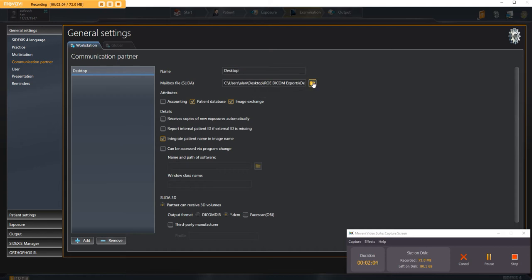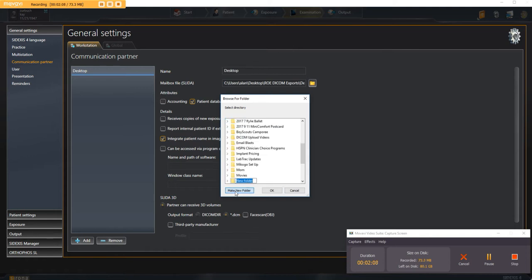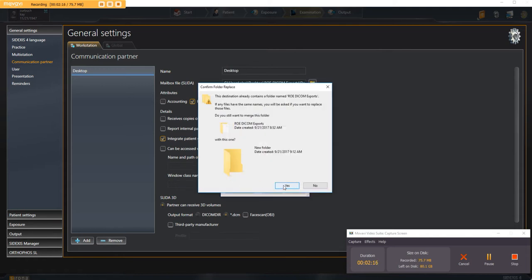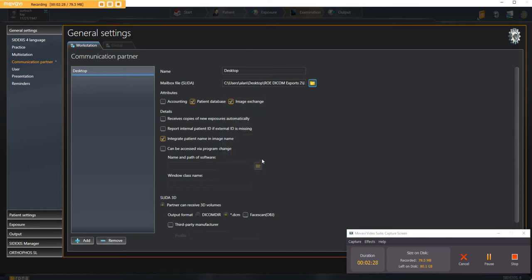You click the little box here, you browse for the desktop, you make a new folder, call it DICOM exports. Click okay, now there's a folder on the desktop.